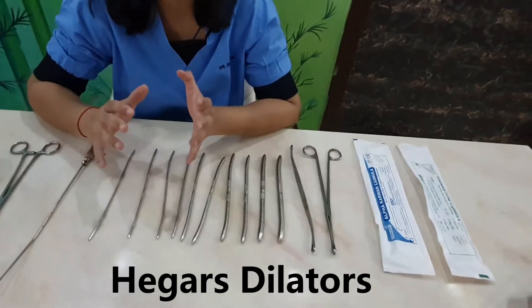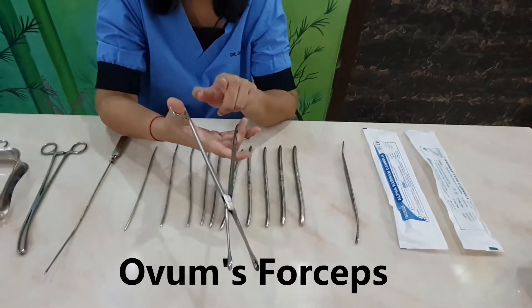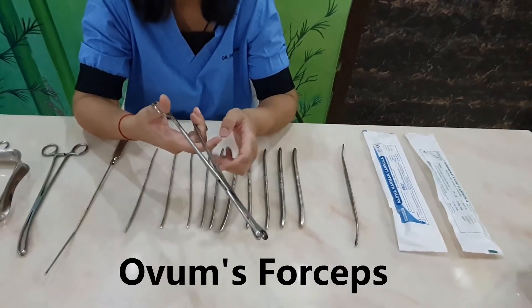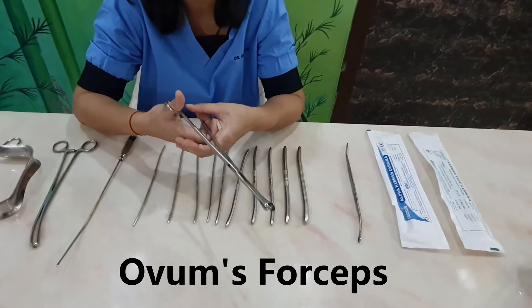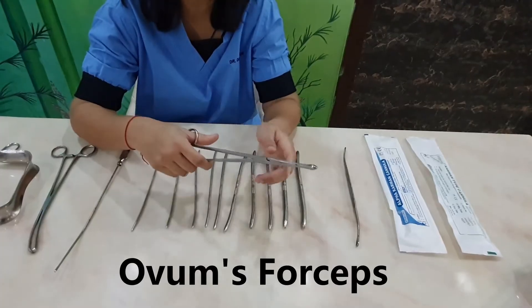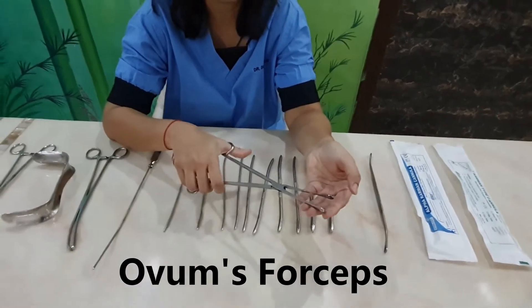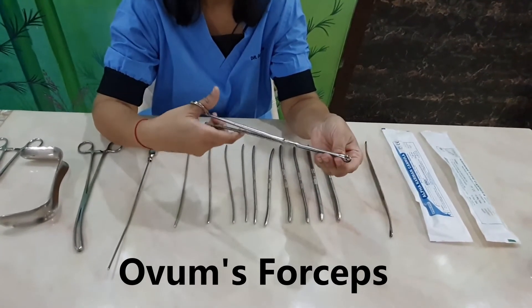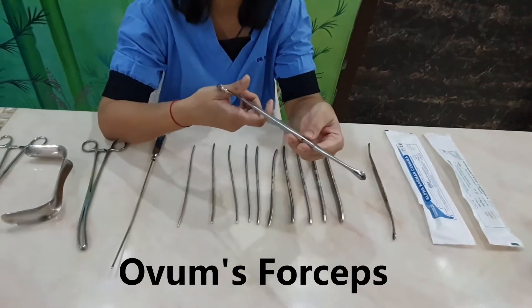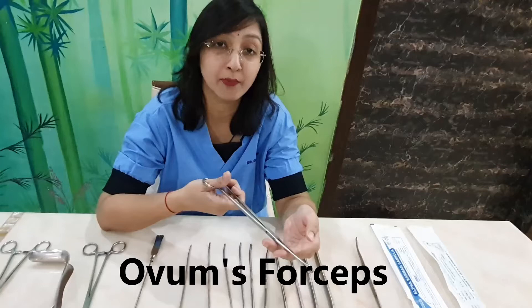After achieving the required dilatation of the internal os, we use ovum forceps. The ovum forceps is a unique instrument — it does not have any catch, specifically so it doesn't cause trauma to the uterine wall. If it grabs some uterine tissue, it won't cause harm. There are serrations at the upper end, designed to prevent crushing of the conceptus. We insert the ovum forceps into the uterine cavity with rotational movements and remove the products of conception.